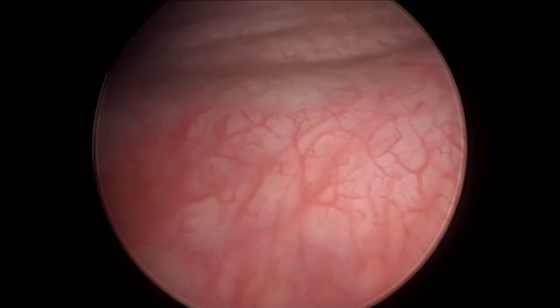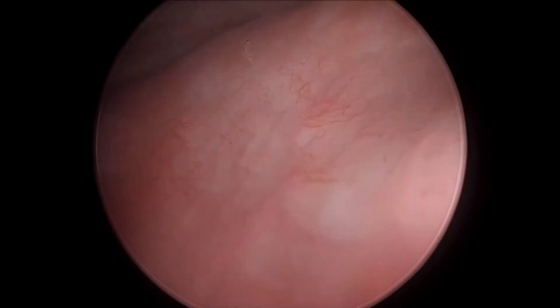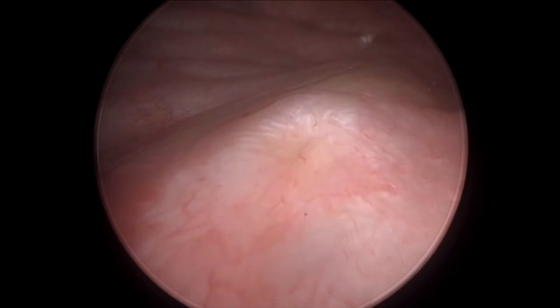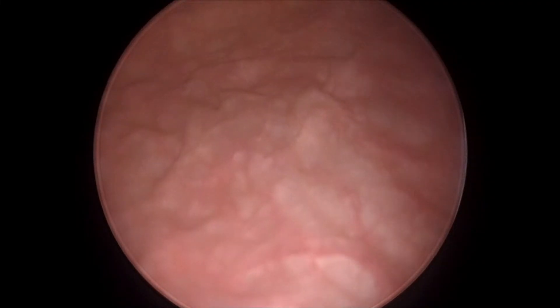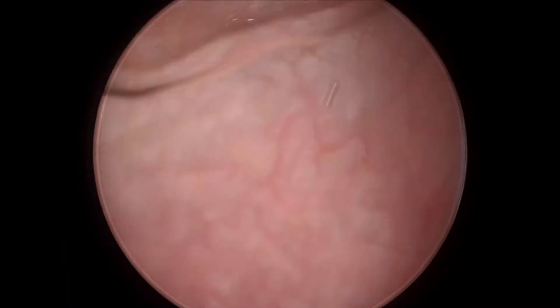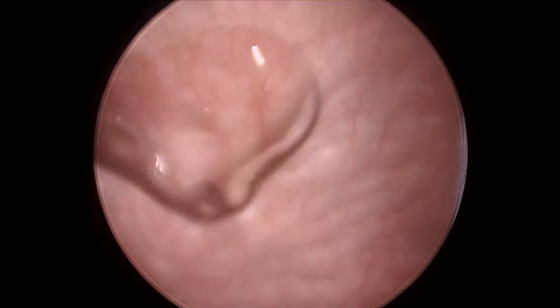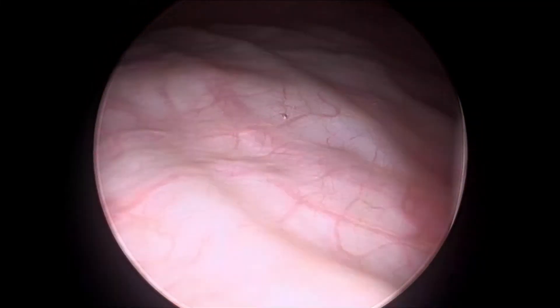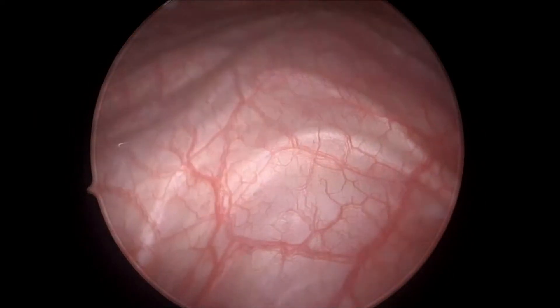This is called the ureteric orifice. This is the inter-ureteric ridge — that is the first ridge, in between the two ureteric orifices, and it can be easily found. Here you have the left ureteric orifice and you can see peristalsis with urine coming out repeatedly every minute. This is the posterior wall of the bladder — a little corrugation is present normally when deflated. Turning the light cable down, you can see the anterior wall of the bladder with small bubbles that disappear once you fill with fluid.